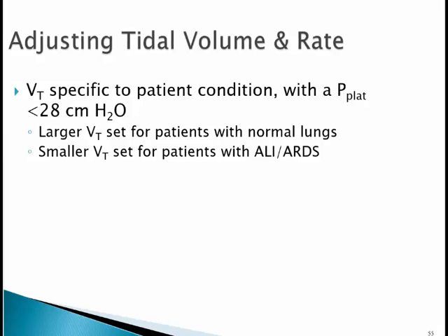Adjusting the tidal volume and the rate. The tidal volume is specific to the patient condition, again with a plateau pressure less than 28, although we've been calling it 30, right? Again, that plateau pressure trumps everything. We want to keep it below 30 as much as possible. A patient with normal lungs that has normal compliance, then you might be able to set larger tidal volumes. But in the case of ARDS or acute lung injury, smaller tidal volumes are called for.